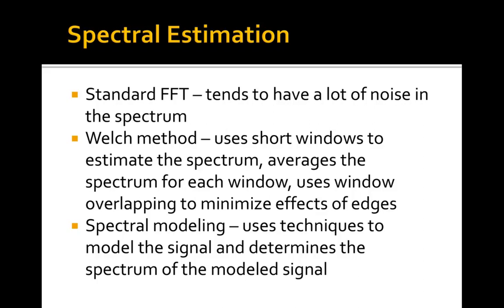It minimizes any artifactual signals in the time domain, because if there is one segment of the data where the spectrum is way out of line with what it is everywhere else, you can assume there might be an error, do some kind of automated testing, and just throw out that particular window. But mainly the Welch method has the effect of smoothing the frequency spectrum.